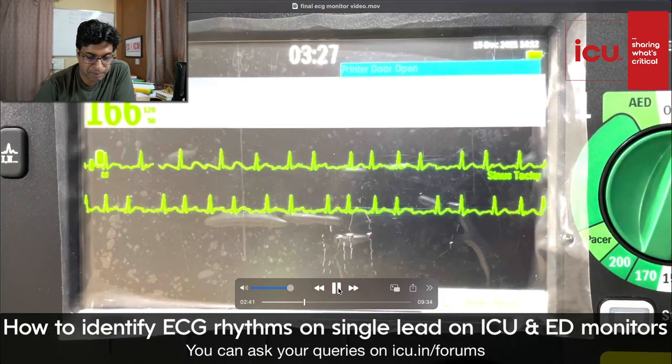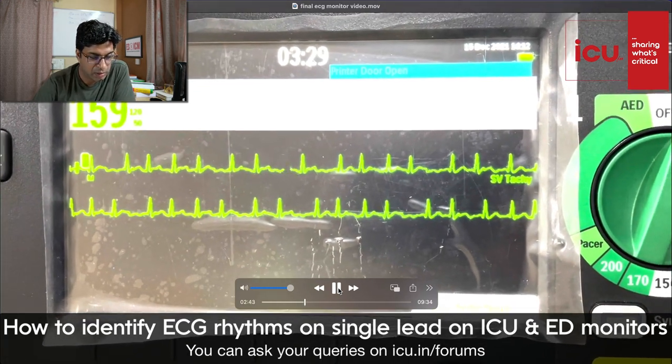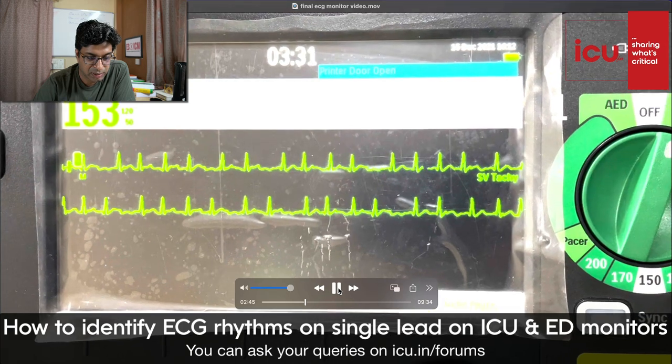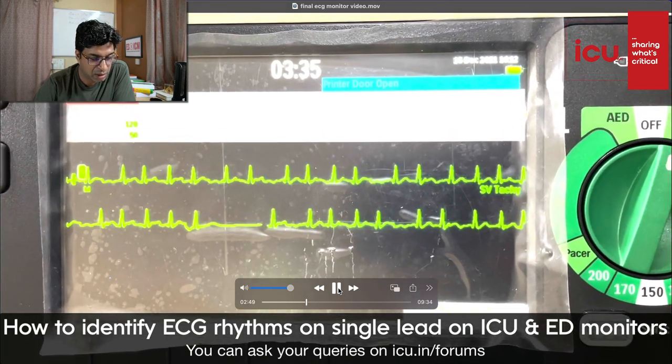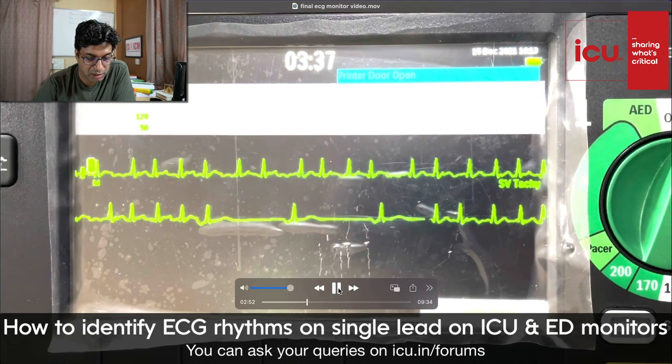Okay. Let's see what next comes. Still atrial fibrillation, irregular. Oh, something has changed.